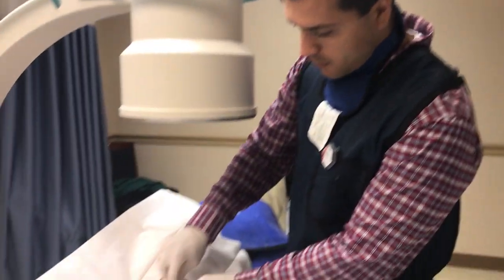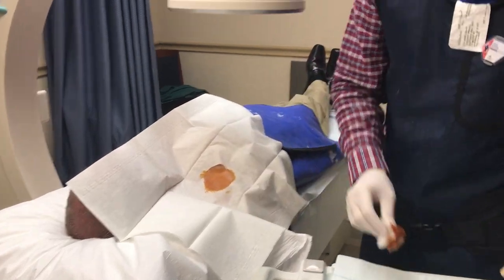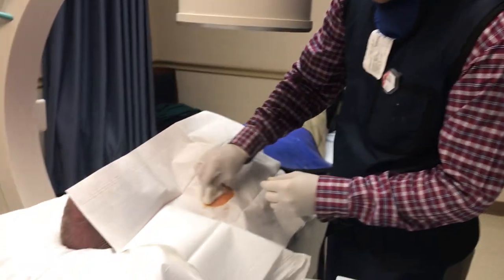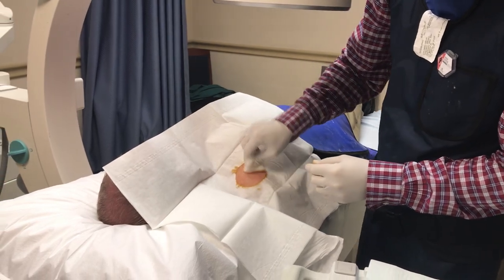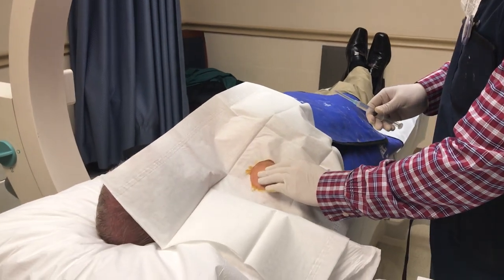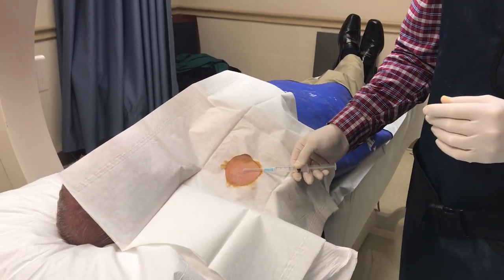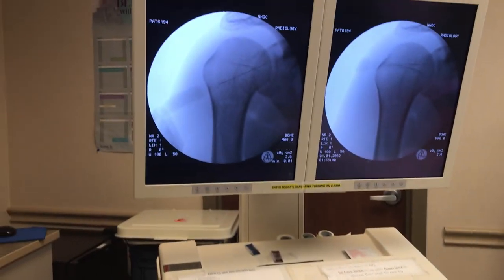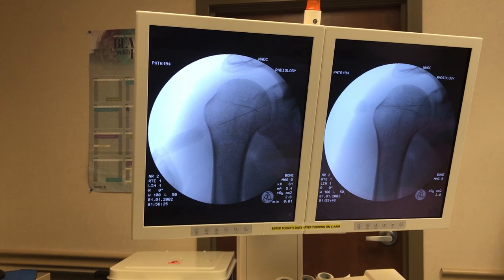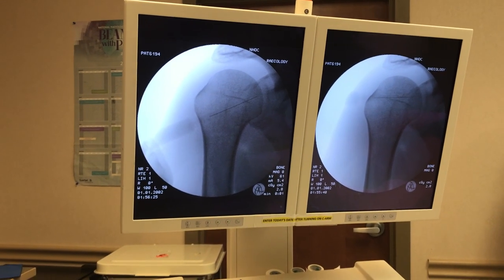I'll wipe him off with betadine and alcohol to sterilize the skin. We have him draped out here. The patient's arm is to his side with his palm up to get the biceps out of the way.